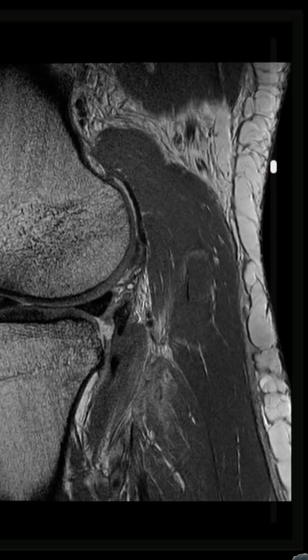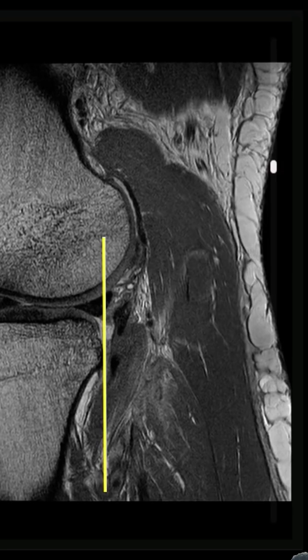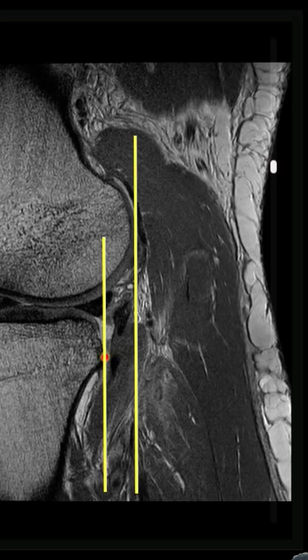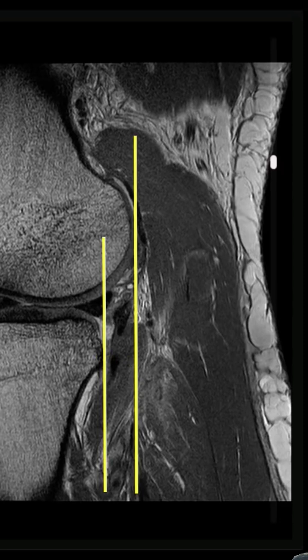You can see anterior tibial translation, with the posterior margin of the tibia being well anterior of the posterior margin of the femur. Normally this should measure around 4mm, however in this patient it is measuring up to 10mm.